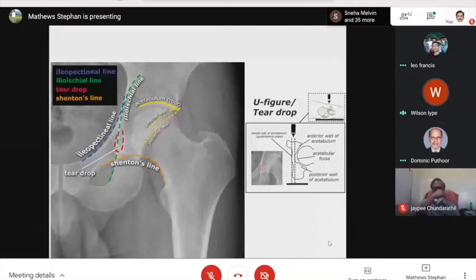With pelvic fracture fixation, these lines are all now very important. That's why I suggested that template on pelvic acetabular fractures, which unfortunately I happen to be the chairman of the international conference.